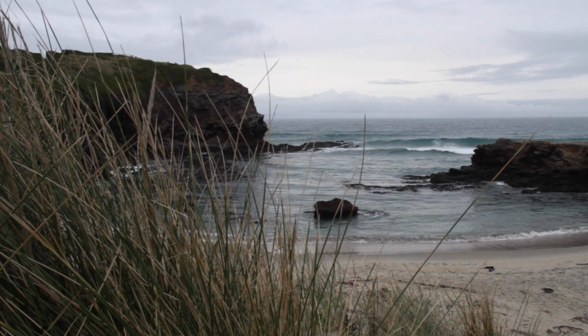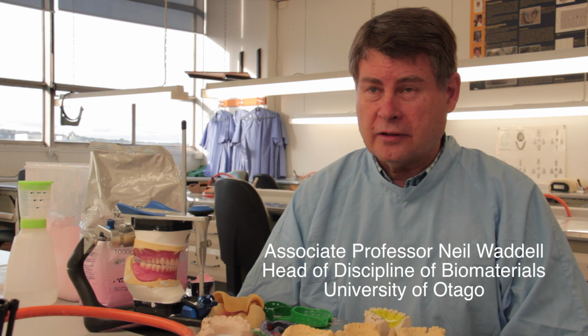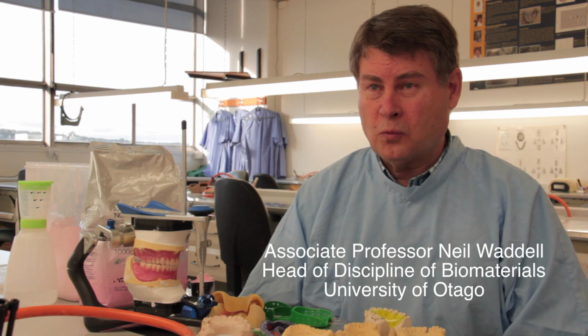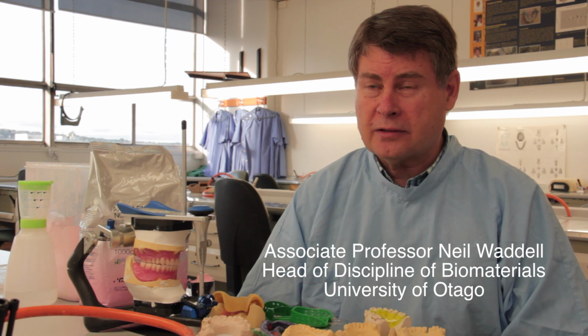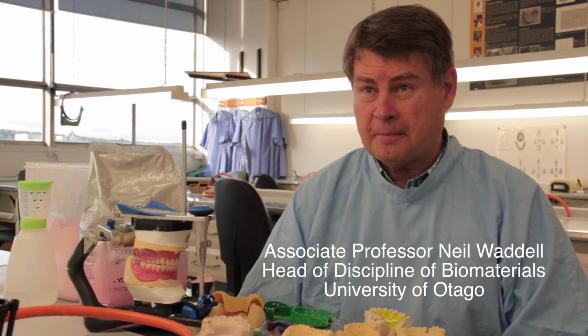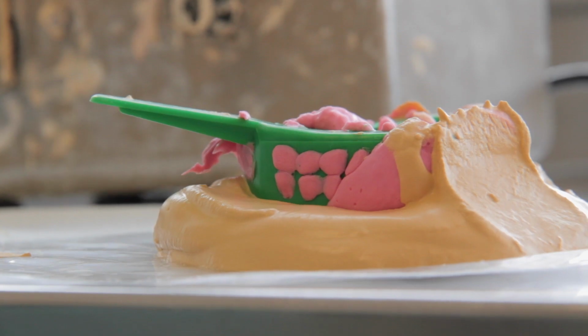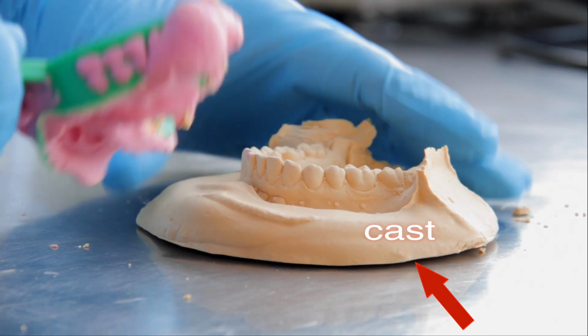Scientists call it biomaterial. So biomaterials in dentistry are a term used for a wide range of materials that we make teeth out of, appliances, and so the term biomaterial means something that is acceptable to the mouth that won't cause any harm. Using the tray with the impression of your teeth, the next step is to make a cast where you can see the shape of your mouth.